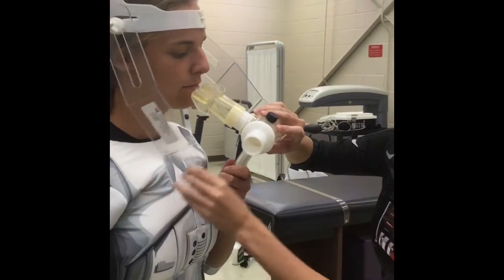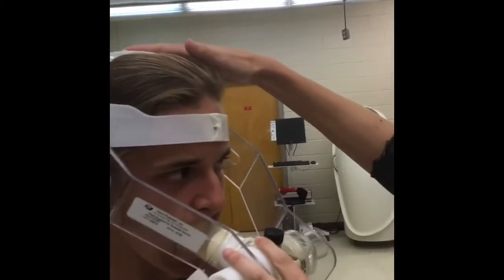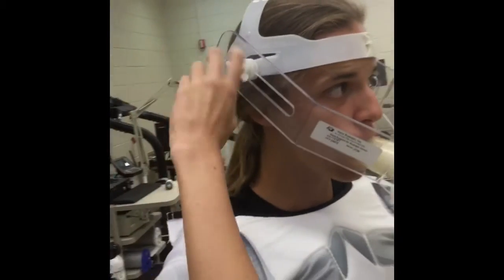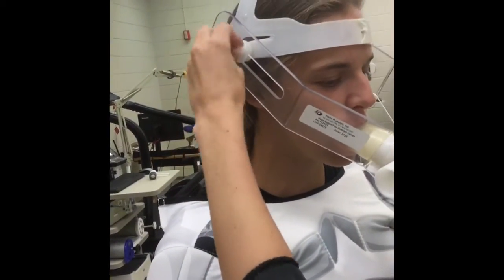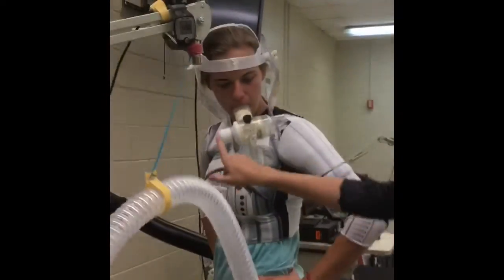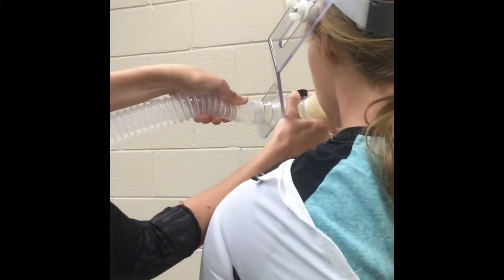The participant will be asked to put the mouthpiece in her mouth at a comfortable location. The mouthpiece may need to come closer to her, so adjust the headpiece accordingly — righty-tighty, lefty-loosey. Have the participant straddle the treadmill. Remember that the white valve must be facing away, and the plastic tube goes into the clear part — pinch it on and allow a quarter of an inch of room.